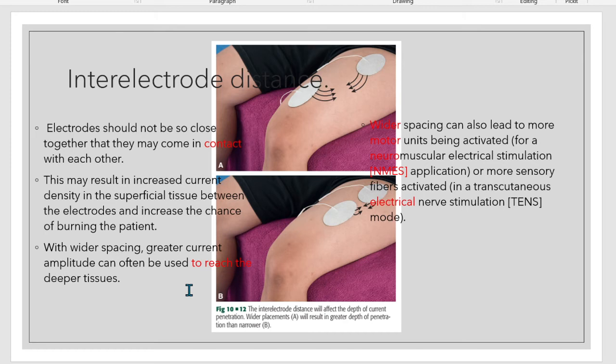That means the problem is in the single-jointed quadriceps muscles, because the rectus femoris can assist, so the patient can still flex the hip. If your main problem is purely in the knee extensors, which is your vastus muscle, how do you stimulate your vastus muscle?